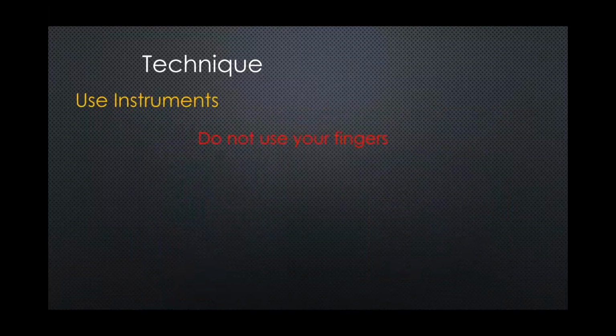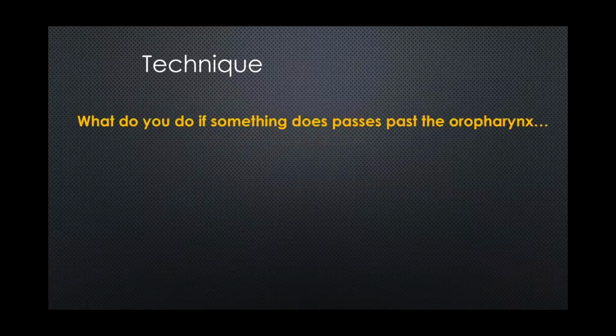Okay. Next, use instruments. We're doctors, we're surgeons here. We use instruments. Don't use your fingers. There's a couple times where I want you to use your fingers, and I'll cover that in a few seconds, but use the instruments that we have available. Less chance of damage and hurting yourself. Okay, now let's talk about what happens if.